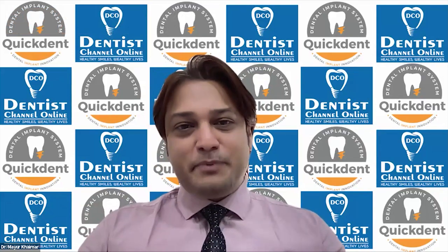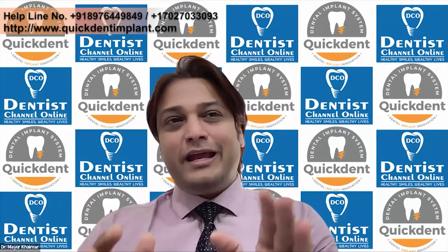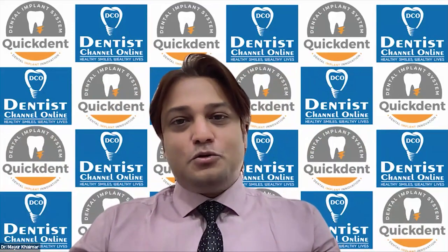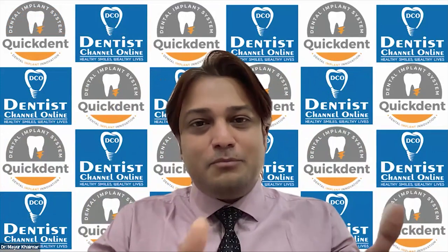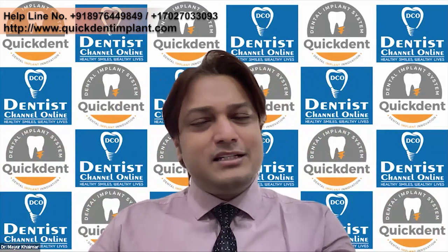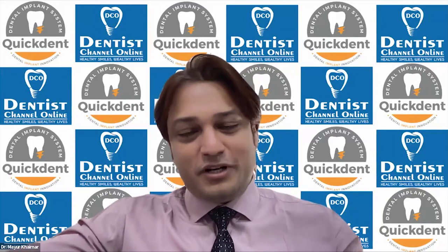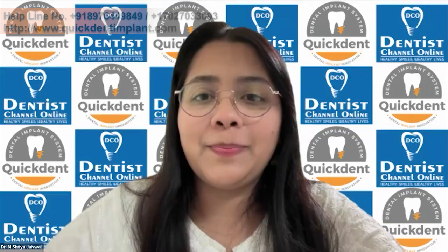So you have to buy the respective components of the particular system. There is nothing hard and fast. You can join any two-piece implant to any other company's two-piece implant. That's not a problem. The problem is when you're connecting a one-piece implant to a two-piece implant. So here you have to do only one thing: call the representative of the particular company and buy the respective components, or ask for these components from your friend, which is easier. I don't think there's any problem connecting two different companies, but you should not use one company's component on another company's implant. That's not recommended.